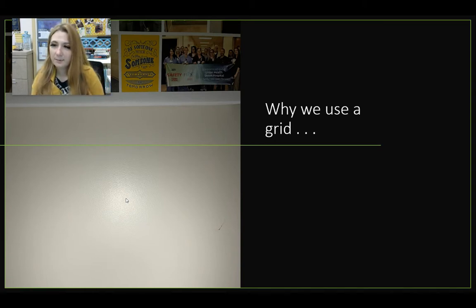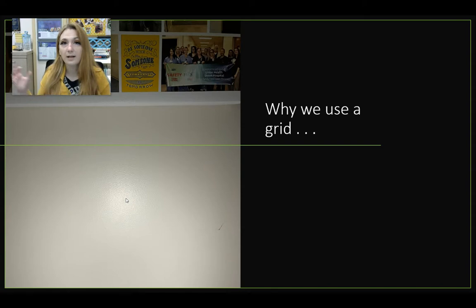Now, when we talk about grids, we also need to mention the Compton effect, so scatter radiation that happens in the room. We have this radiation kind of bouncing around in there, and that can wreak havoc on a beautiful image because it comes back to the image receptor and makes it not as detailed. It kind of gets this fuzzy gray look, and that grid will actually prevent that scatter radiation from touching your image receptor.